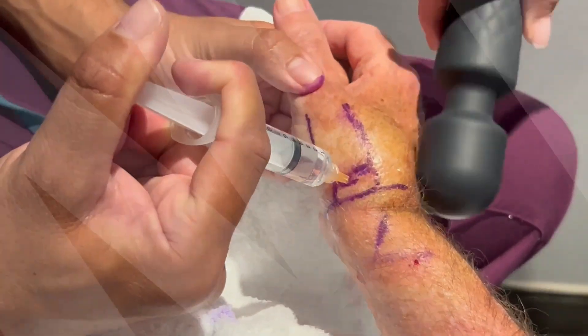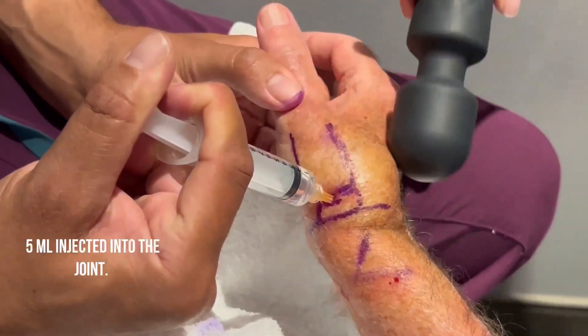Finally, we inject about 5 cc into the joint.